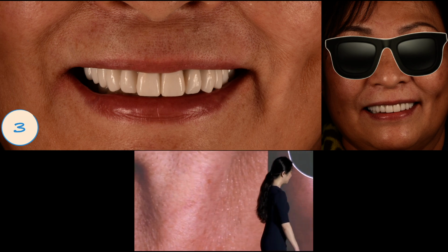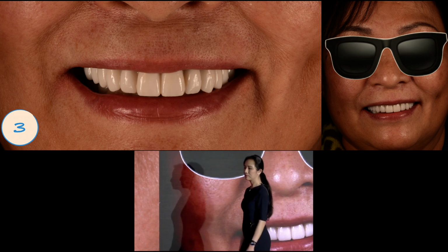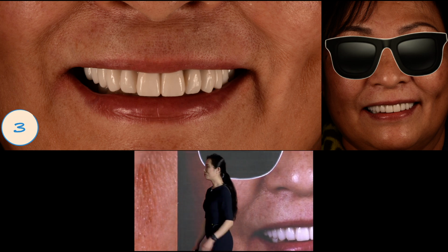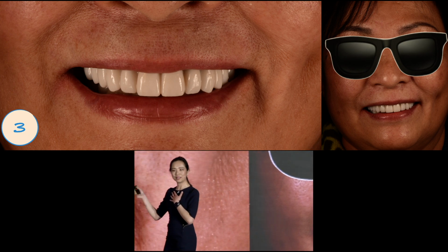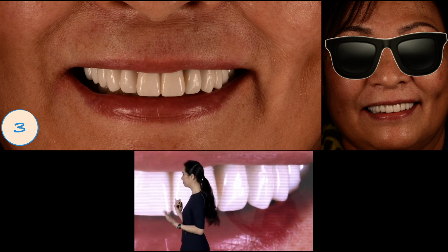So this is, again, monolithic zirconia. This is the older version. But we still got great results. She loved it. I promise you, I did not select this shade myself. The patient really, really, really, really wanted it. It's a little bit bright, but it looks great on her.